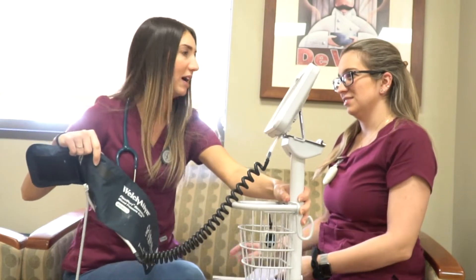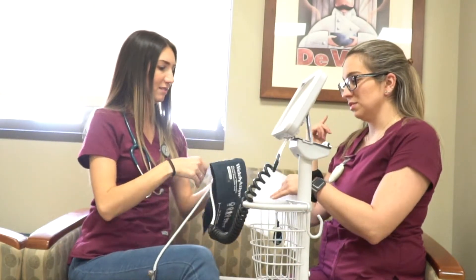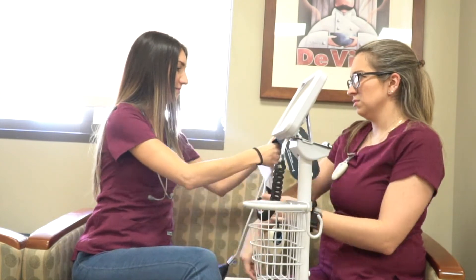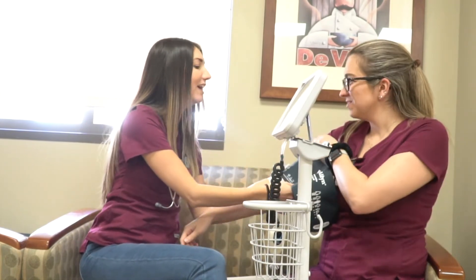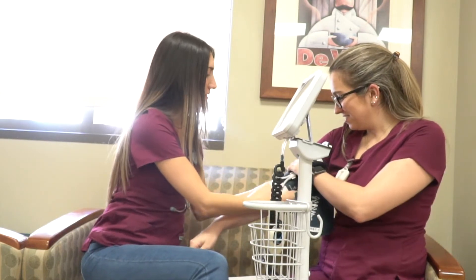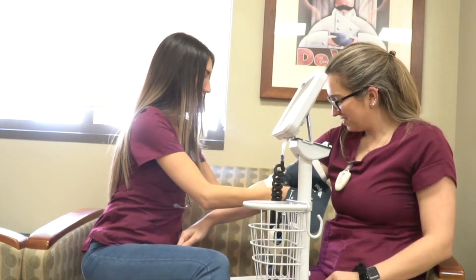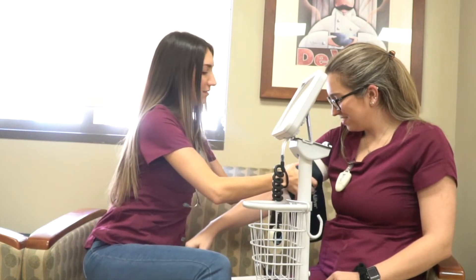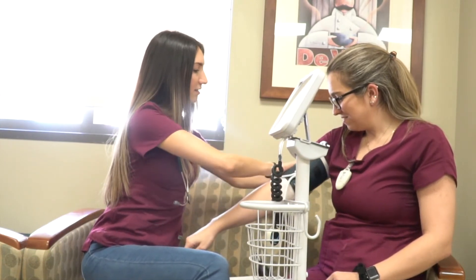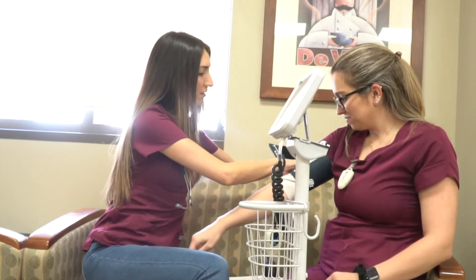How to take a manual blood pressure. First have your patient sitting or sitting up in the bed. Have them rest their arm down. Start with a cuff that is the appropriate size for their upper arm. Wrap the cuff around their upper arm with the cuff's lower edge about one inch above the antecubital fossa, which is where the elbow bends.